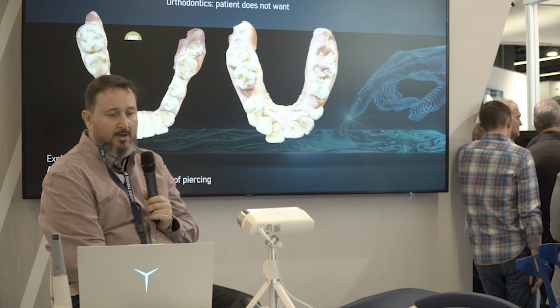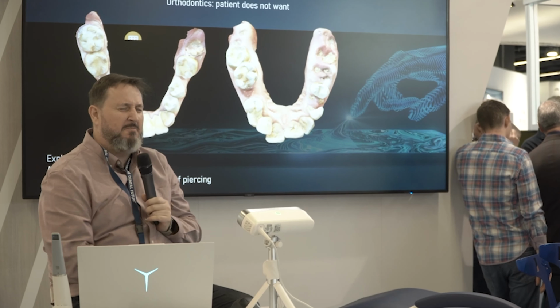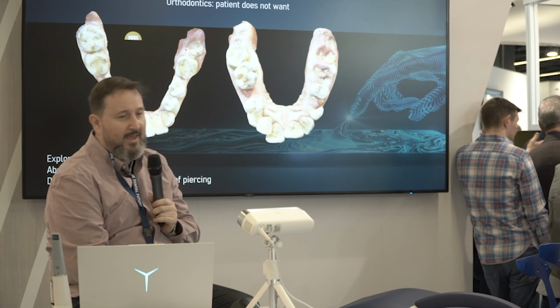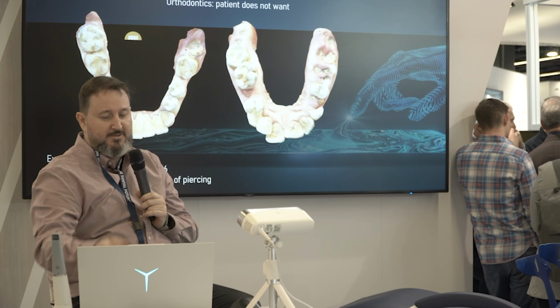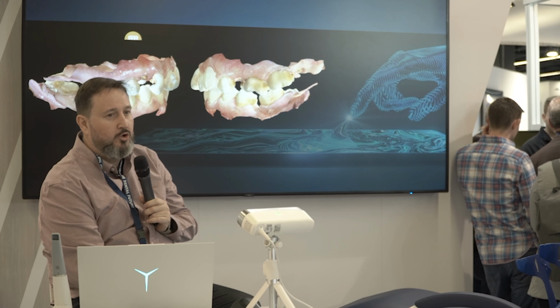Okay, this is a patient. She's Yolanda. She's 38 years old. She's female. She's a very heavy smoker, with very bad hygiene, you know, and she doesn't want to make any kind of orthodontics. None. So we make the exploration. We can see there are many absences, many defects. Let's look at the occlusion.